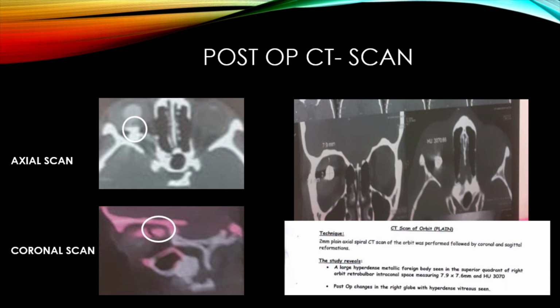So, one of the points you mentioned, Akshat, that ultrasound is contraindicated in trauma. I think that is a little bit of a blanket statement, and I don't think you can say it like that. We already told you cannot use the word contraindicated now. You can say that if it is a very severe trauma where there is a risk of expulsion of the intraocular contents, or if it is a very badly disfigured eye, then obviously it is contraindicated. You can't do ultrasound. But if it is a small wound, say a self-sealed corneal wound where you do suspect a foreign body, that is important.